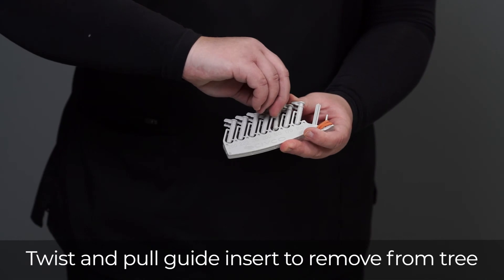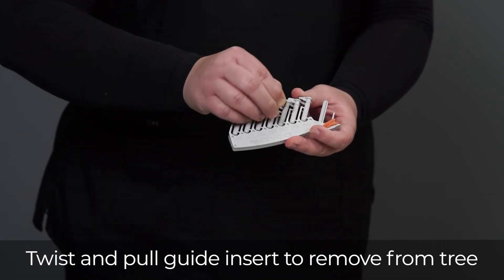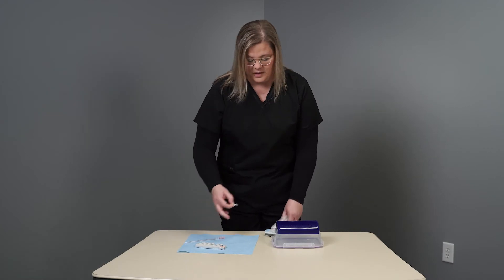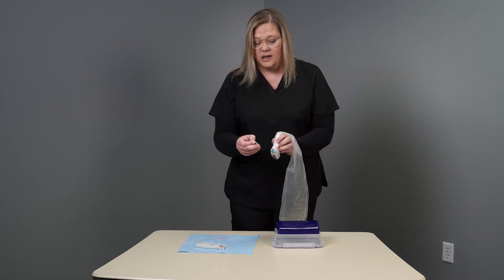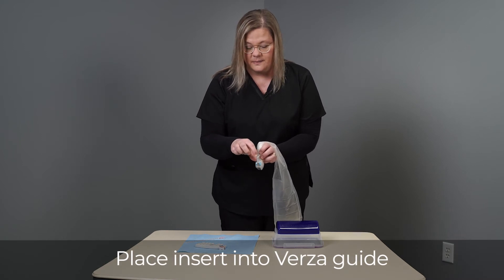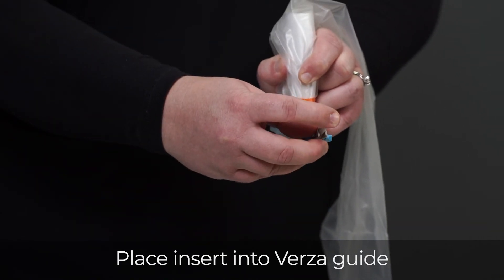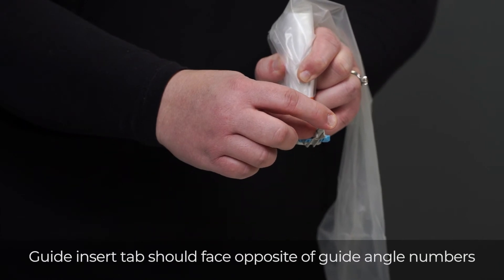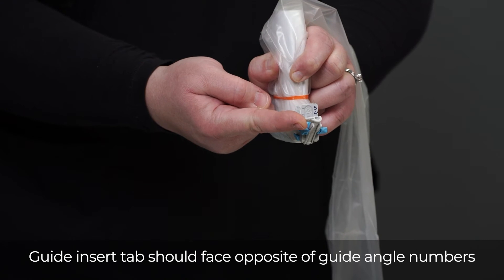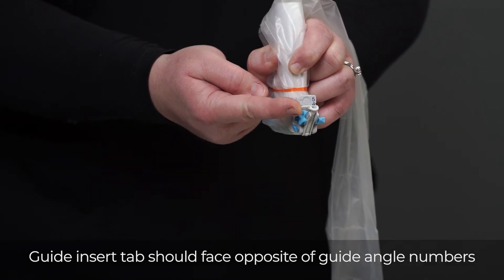You'll want to remove the gauge size by twisting and pulling it off the tree. The next step will be to insert your gauge size within the guide body. When inserting the gauge, insert it into the guide body all the way while making sure the tab is fully secure back to the right-hand side.